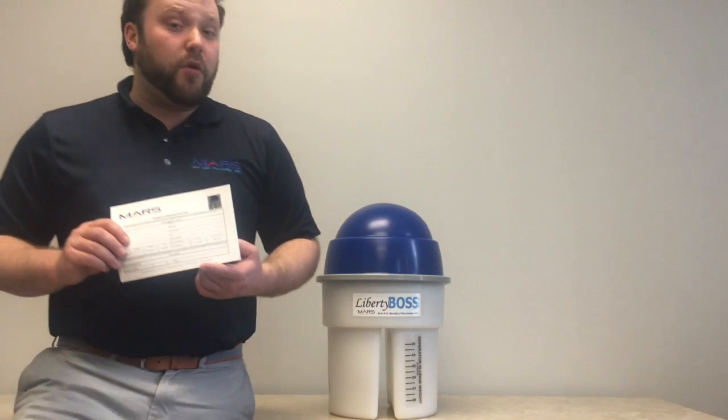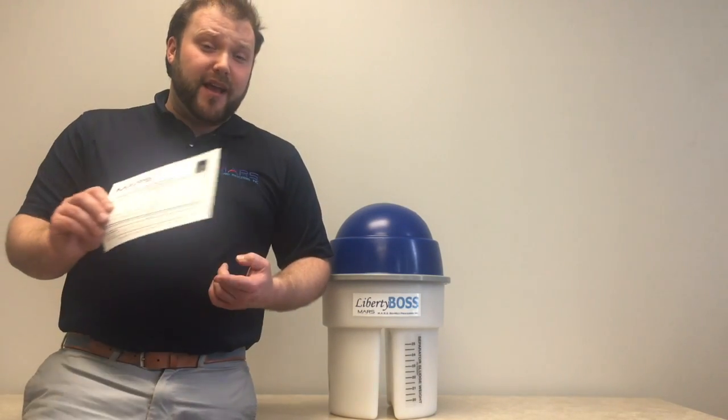One, it registers you for a free advertising program, advertising you as an environmentally friendly dental practice. This also lets us know when your system is due for changing.